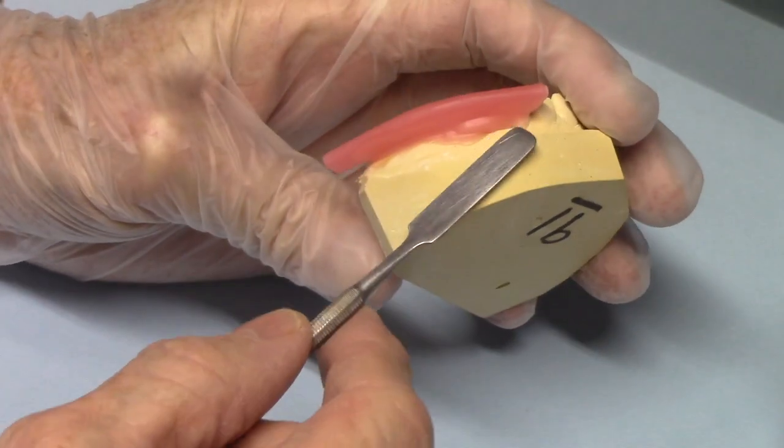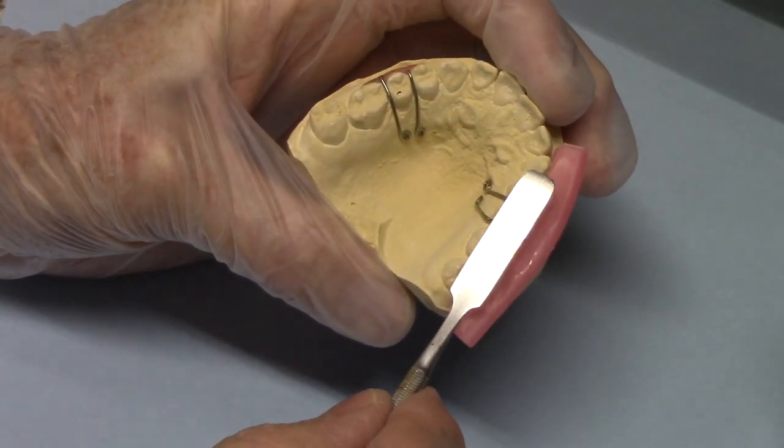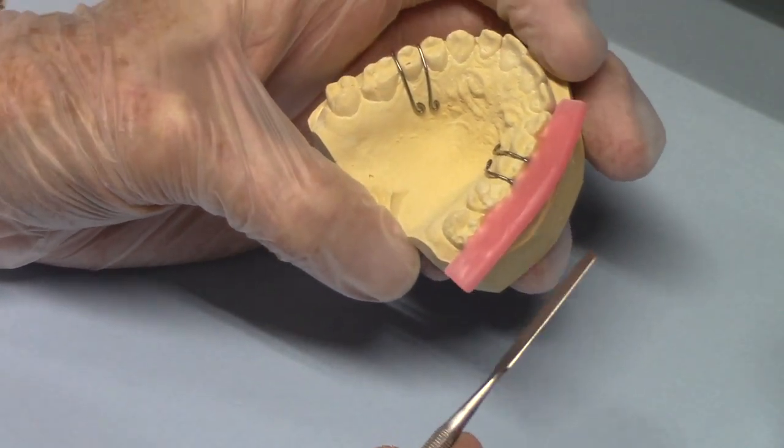It's pretty simple to do. I just wax it here and then I put a little wax here, and that creates a shelf where I can pour the acrylic on the posterior and it doesn't run over and get into the buckle area. And that works pretty well.